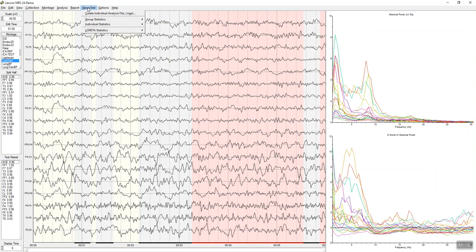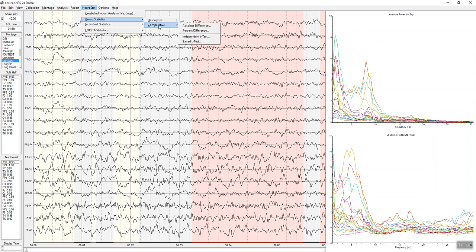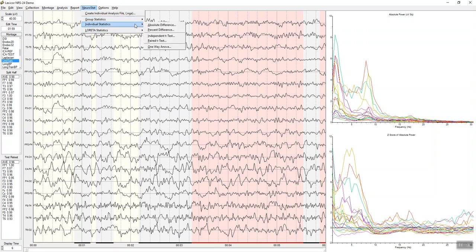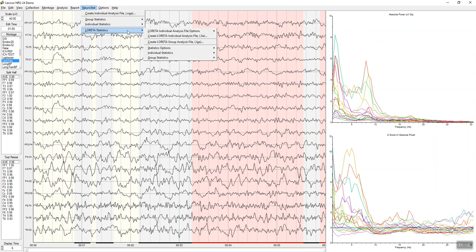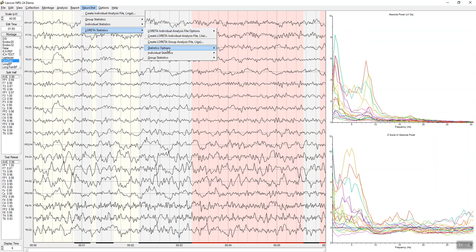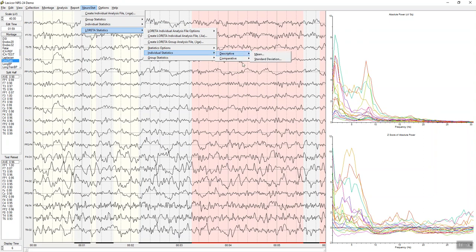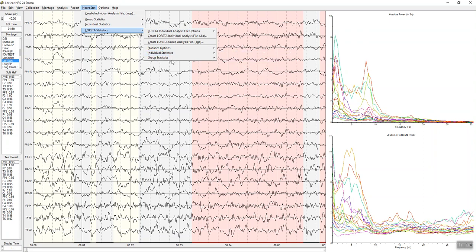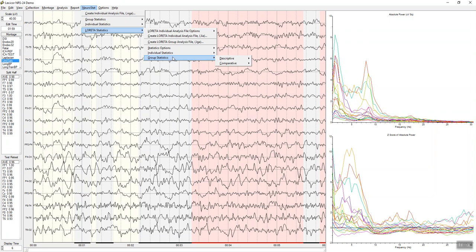You can also have Neurostat, which allows you to do group statistics at the surface, comparative statistics with groups, as well as individual statistics: independent t-test, paired t-test, one-way analysis of variance. You can compare absolute differences, let's say between pre and post treatment or percent difference changes. Similar with LORETA, you can do group analyses, individual analyses, descriptive statistics, comparative statistics, and group statistics. So you can evaluate large groups of people if you wish that were maybe treated or not treated or of different symptomology or an individual that you track over sessions.